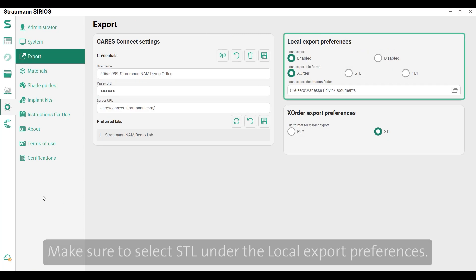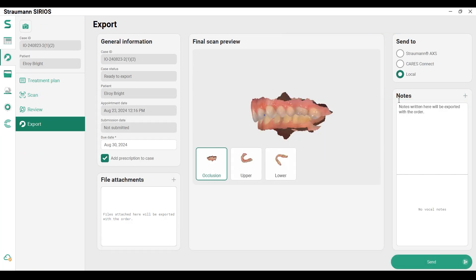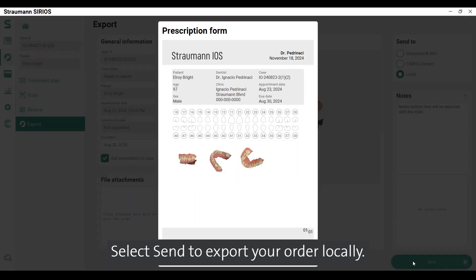Make sure to select STL under the Local Export preferences. Then select Send to export your order locally.